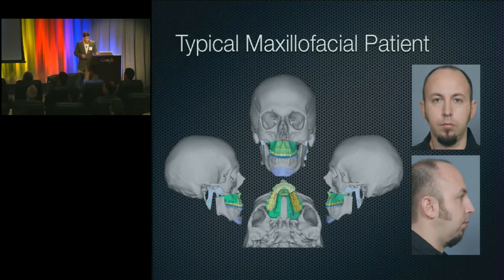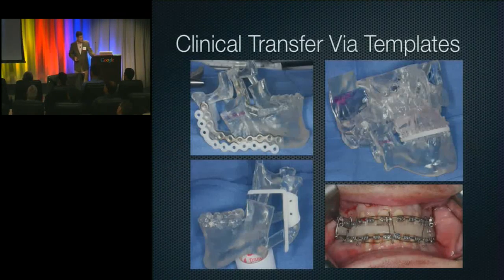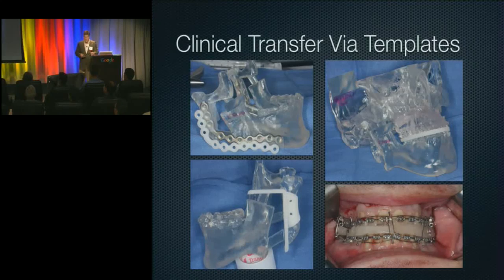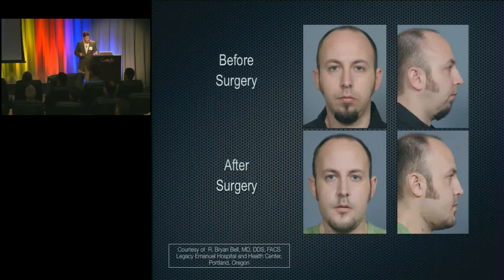So in this case, in the computer, we're planning out moving things around to a new position and guiding those things with templates. Now, I purposefully did not include a lot of bloody images today, so that you're thankful, because in the field there are a lot of things that are a little hard to look at. But in the end, we're guiding these big movements of bone around using templates and models and plates and jigs and different ways of fitting things together. These are still in the hundreds and low thousands of cases. But we can take somebody like this and predictably help the surgeon get this kind of a result, which has not only a cosmetic element, but also a major functional element.